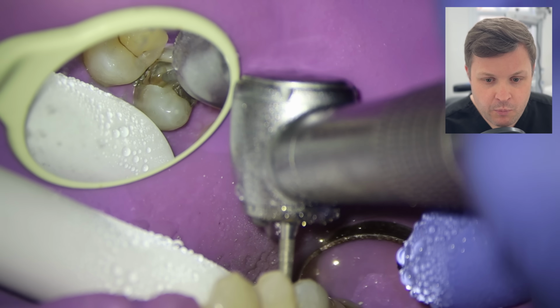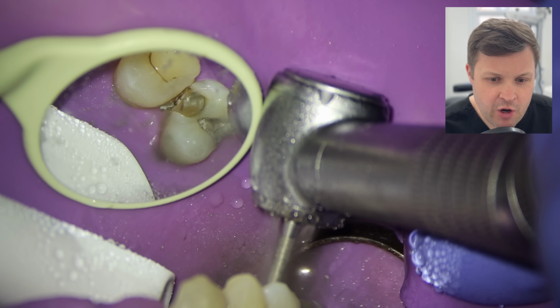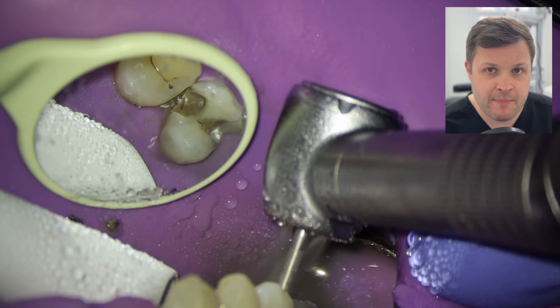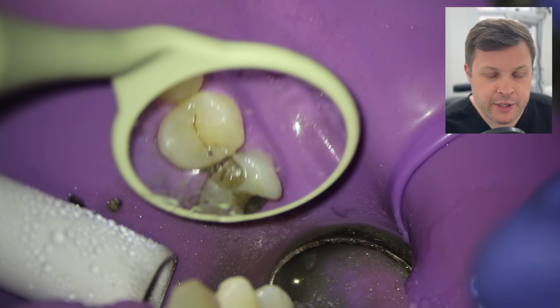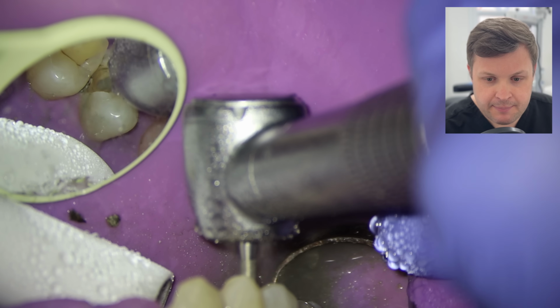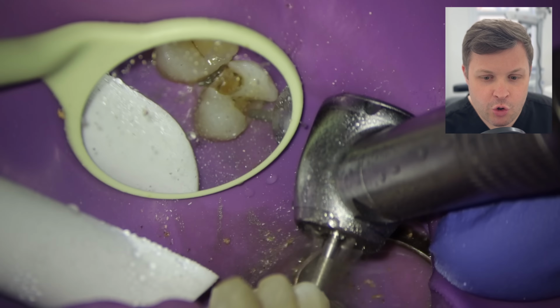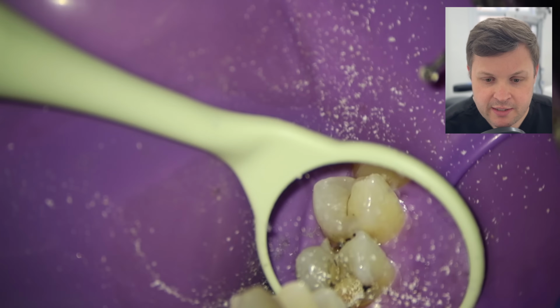And it's at this point where I'm thinking to myself, why has this tooth died off? And we've got a bit of a bridge of dentin in between these two fillings here, and I'm thinking, I wonder if I remove both the amalgam fillings here, and then start to drill out with my slow hand piece, at what point and where is this pulp chamber exposed, and why has this tooth died off? I'm also thinking, there's a bridge of dentin here, and should I drill straight through the middle of this tooth, or could I get some kind of nice little buccal or distal aspect of this tooth and try and save as much of the dentin as possible?